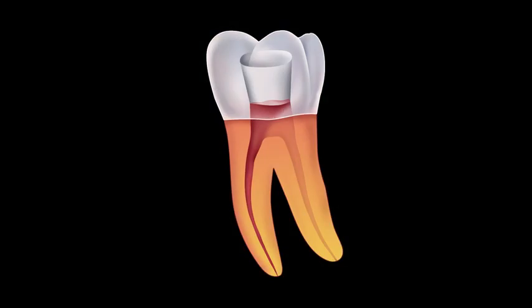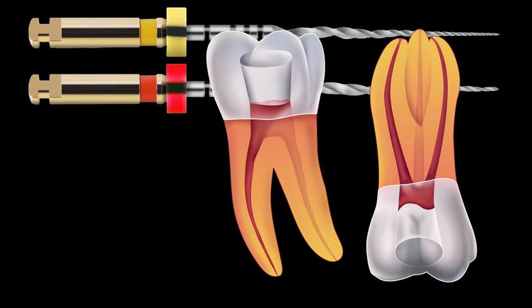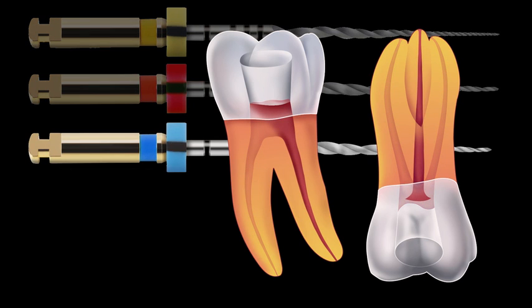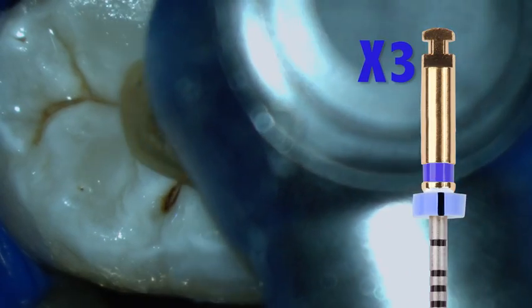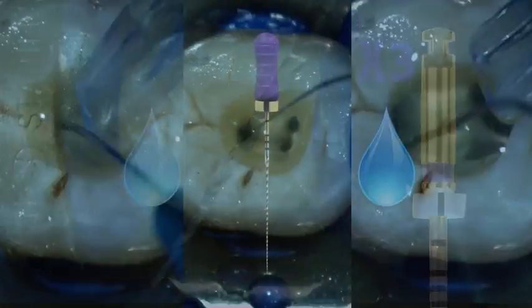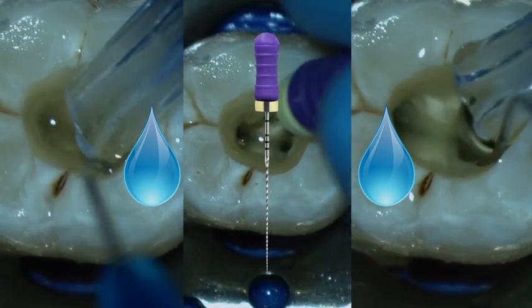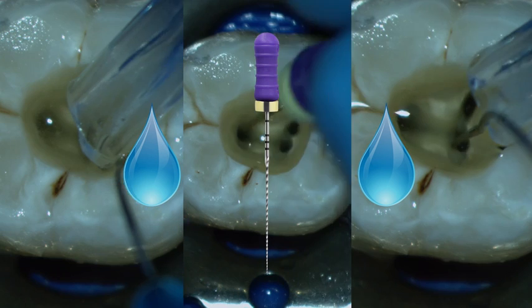In the case of the mesial roots of most lower molars and the buccal roots of most upper molars, only the X1 and X2 instruments are required. Larger canals, including the distal canal of this tooth, may also require the use of a third instrument. Here we introduce the X3. This is again followed by recapitulation with a 10K file and irrigation with sodium hypochlorite. The canals are now ready to fill.